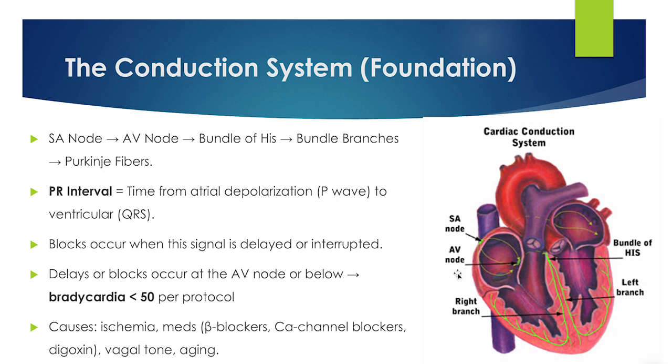The PR interval is the time from the atria depolarizing, which will be the P wave, to the ventricular QRS complex. So if you're talking about the PR interval increasing, changing, or prolonging, we're talking specifically about the time from the P wave to the QRS complex.